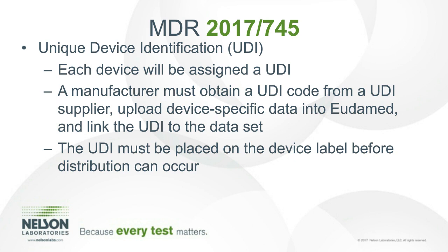And this document does go over that if you have this UDI placed on a reusable medical device, you have to do something called repeated testing to ensure that during the lifetime of use of the device, it does not fade away and the numbers are readable.